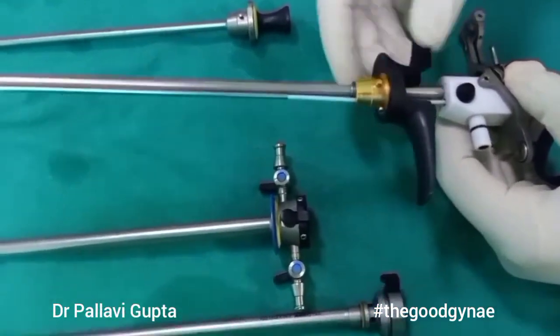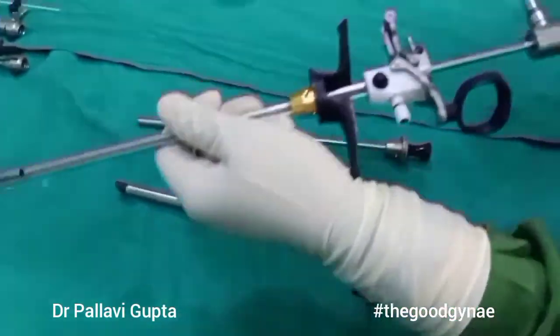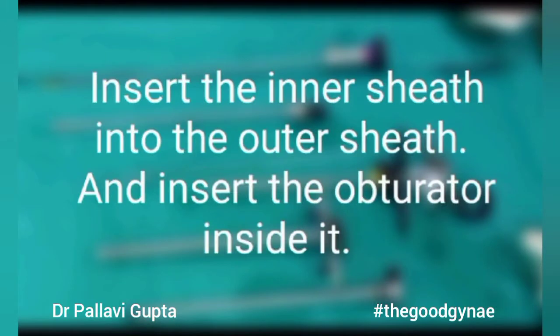We are going to lock it. Next we are going to take the telescope and insert it into the working element, and it should fit as follows.